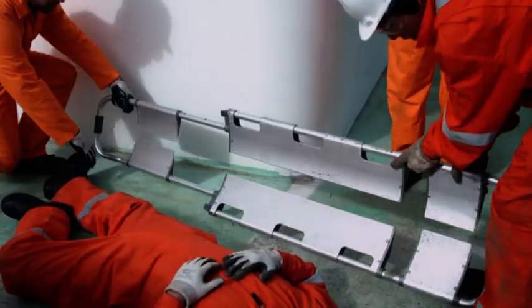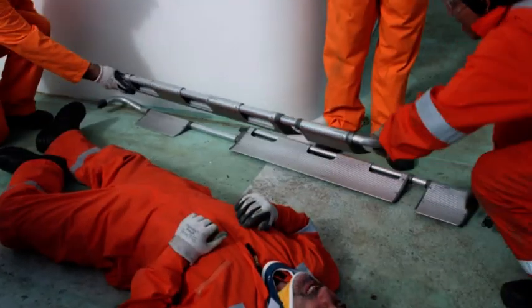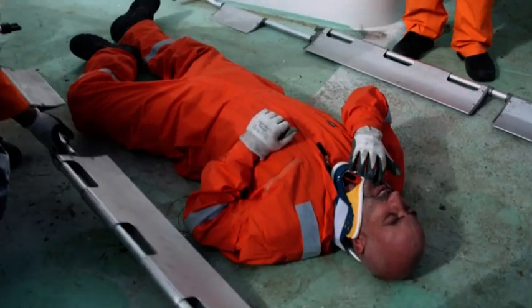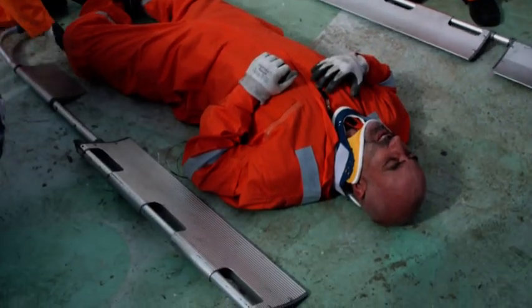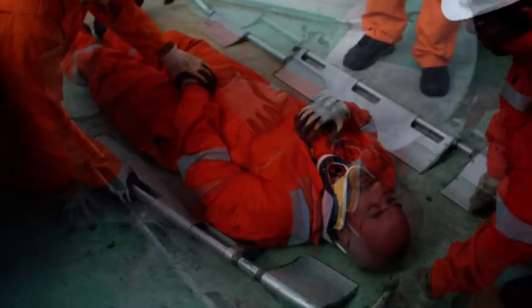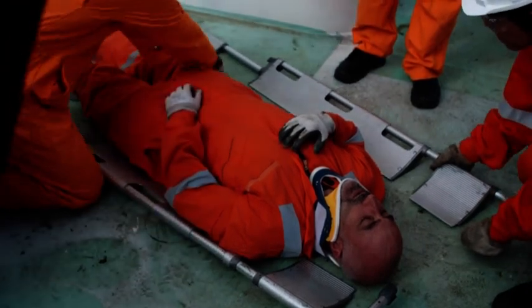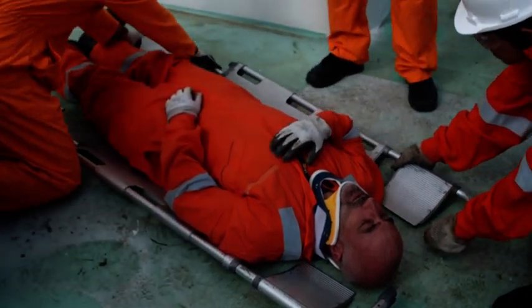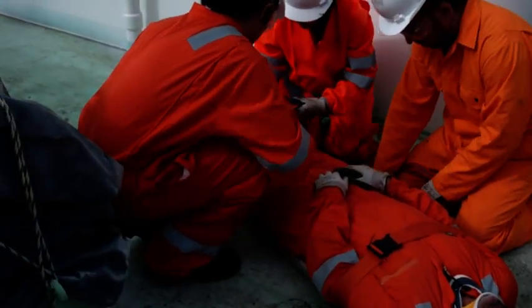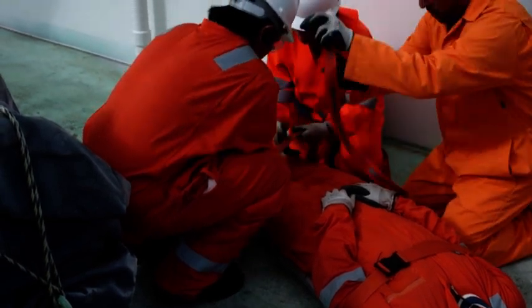Alternatively, you could use a scoop. This is a metal stretcher that splits in half vertically and is sloped in the center. The benefit of a scoop is that each side can be placed alongside the casualty and slid underneath their back, before being reconnected, allowing the casualty to be placed on the stretcher with minimal movement. If any of these stretchers are required, ensure the casualty is placed on with all the straps and buckles firmly fastened before any movement occurs.